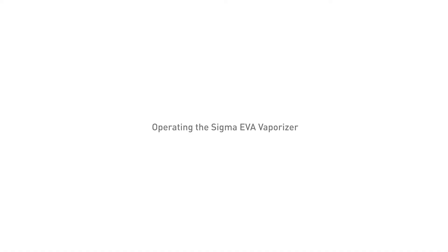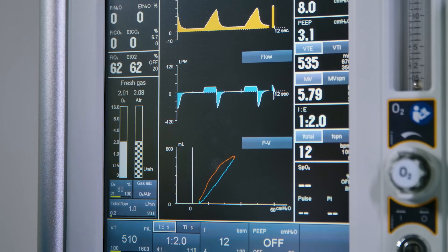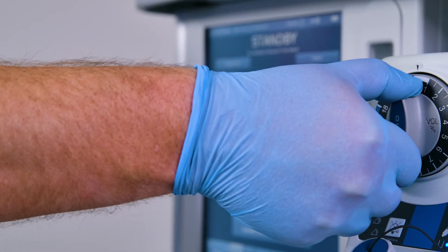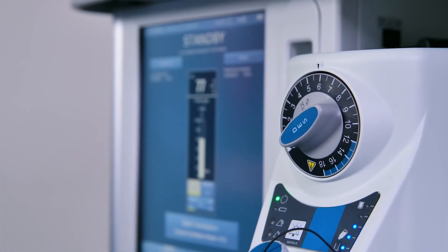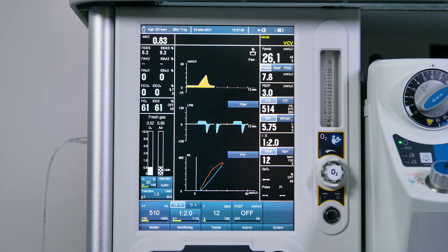Operating the Sigma EVA Vaporizer Delivering Anesthetic Agent. Check that the power supply indicator is continuously illuminated. Set the required fresh gas flow on the anesthetic machine within the range of 0.2 to 15 litres per minute. Push in the control dial and rotate anti-clockwise to set the required agent concentration.